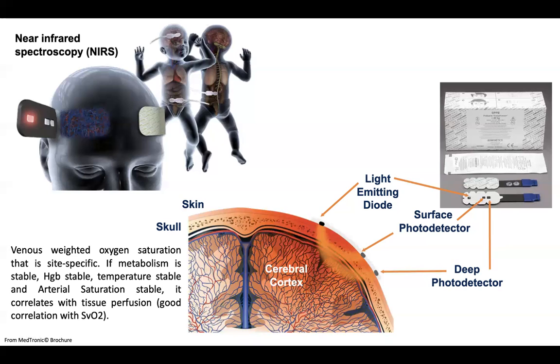Because we can have either allergic reaction, irritation, some of the skins are more sensitive than others, and you want to make sure there's no burns behind it because temperature could rise from infrared, and we've seen it with some other oxygen saturation probes, although it's very rare. But especially in the preemies, you have to be careful because they're more fragile babies, and with any kind of device, their skin is extremely sensitive to it. So we have been, at least locally, very careful with that.